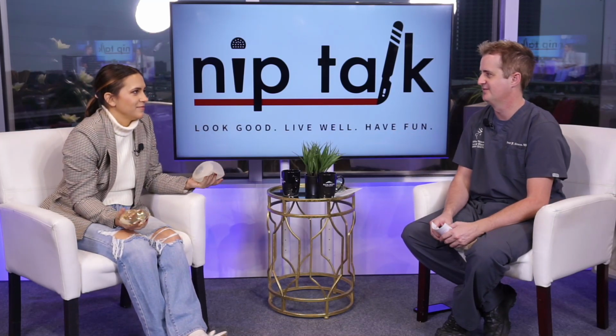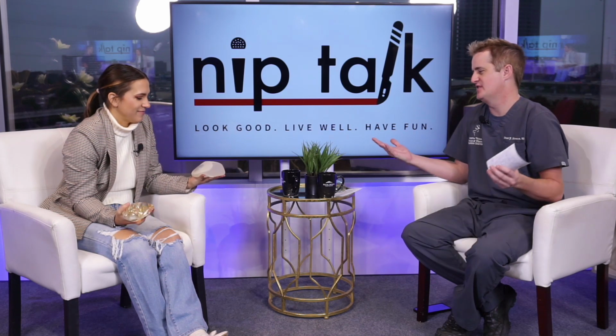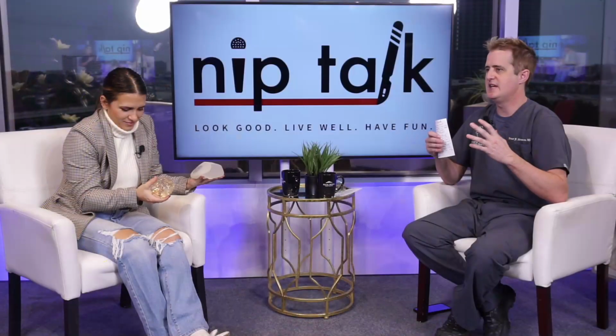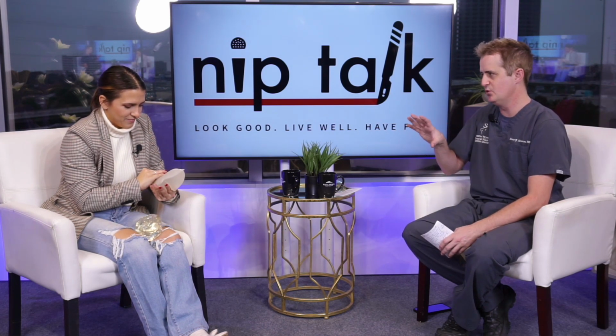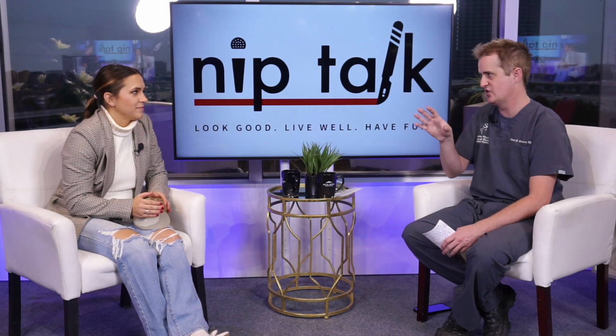Can you feel it? This one just feels more like watery. It is, it's saline. I don't have a silicone textured one, and I'll tell you why. This is what I've got with saline in it, smooth. So the reason that textured implants even exist is the idea that textured implants will actually adhere to the tissues, and so to a certain degree stop the implant from moving, whether that be rotation or sliding in a direction.